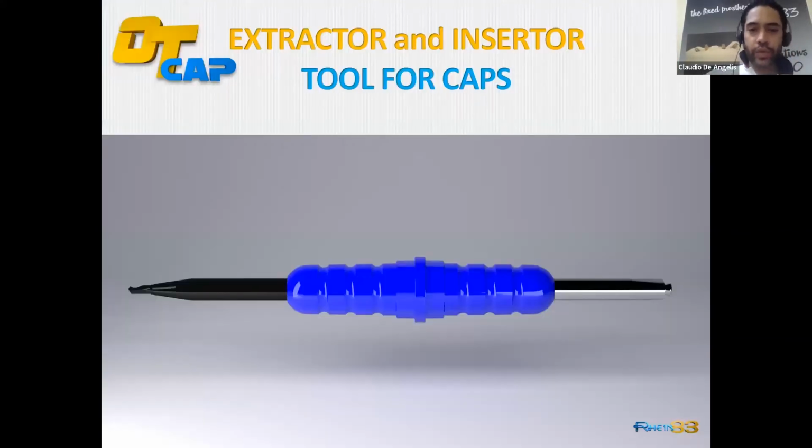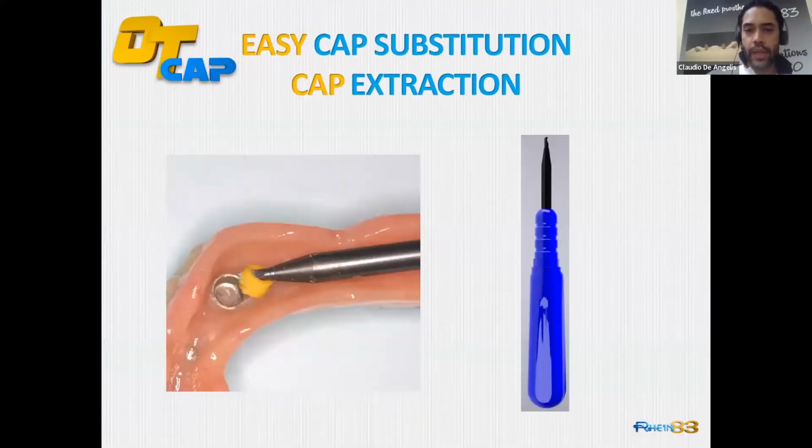A smart tool to remove and to replace the caps. This is basically a double-sided tool. It has a black hook with which you can go into the cap and rotate. By rotating, you extract very easily from the metal housing, from the inside of the denture.